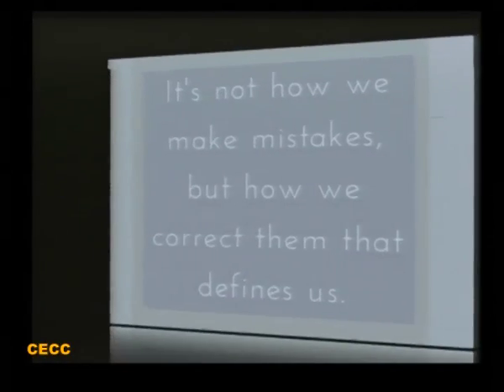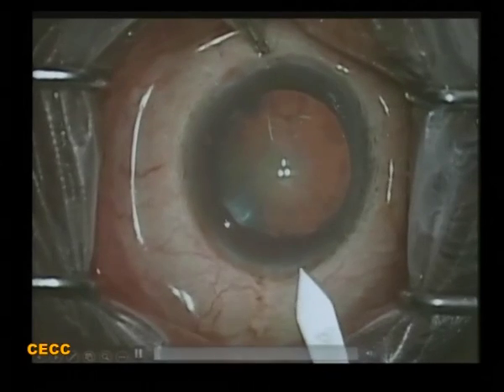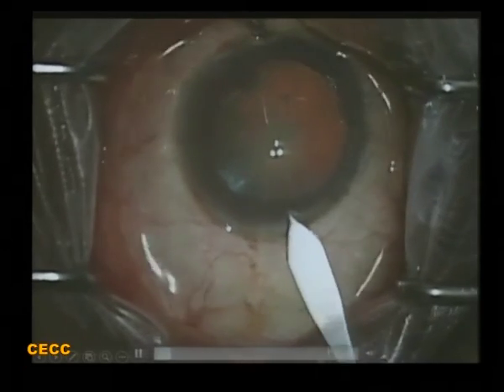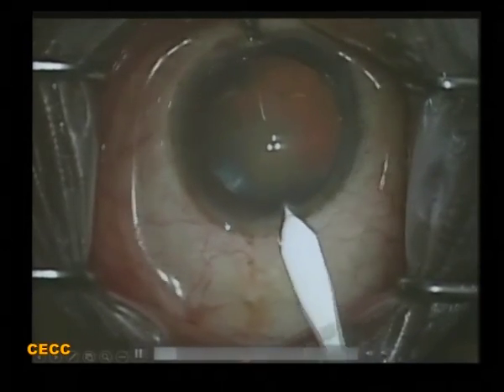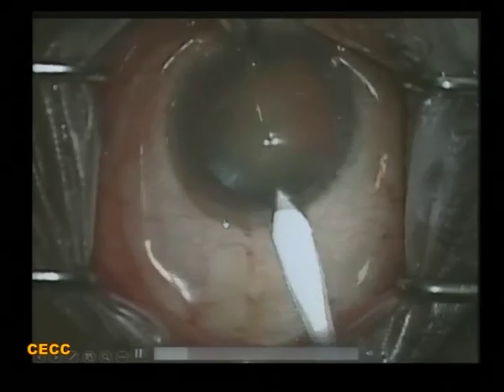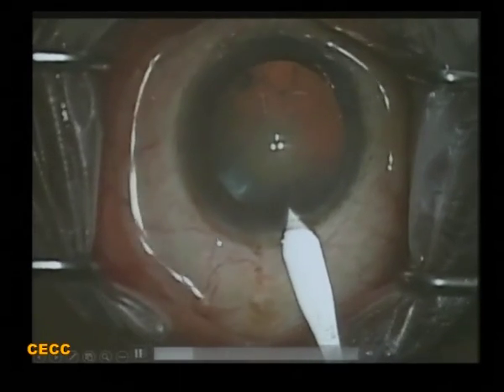We will see 10 videos and try to highlight at least one point we can take back home. This first case is a grade 3 cataract and we are trying to make a 2.2 keratome wound.